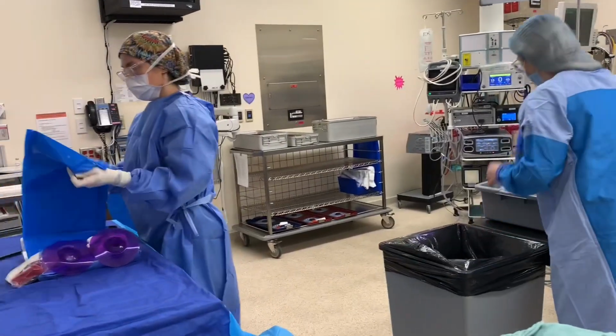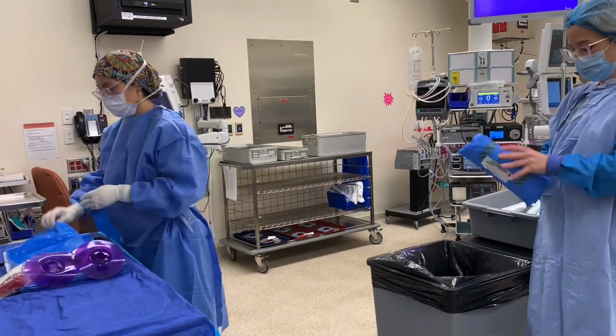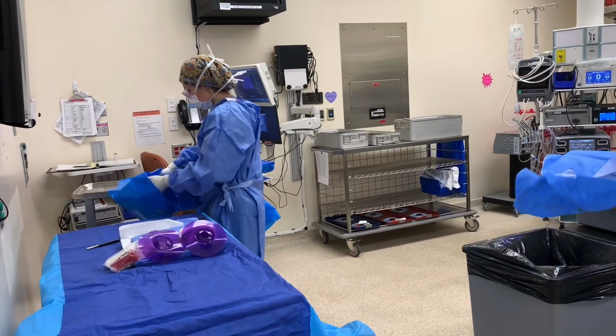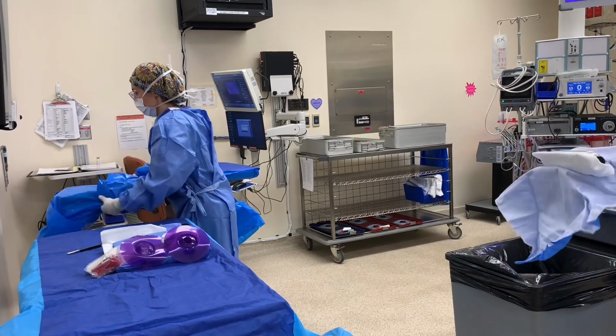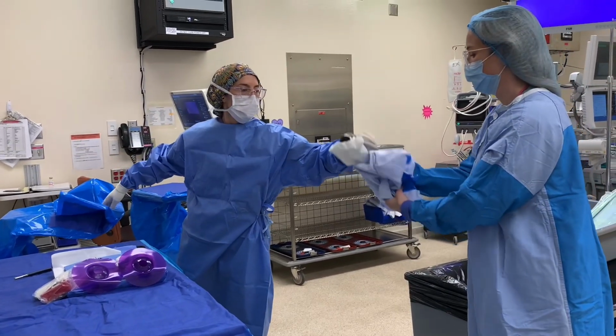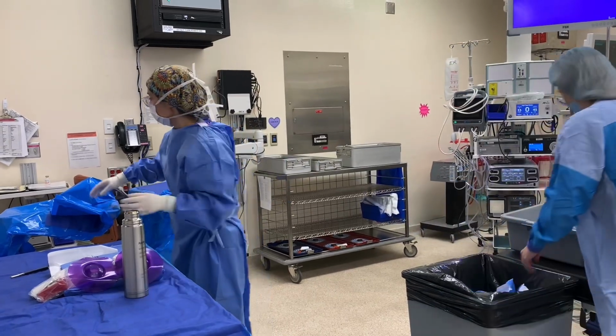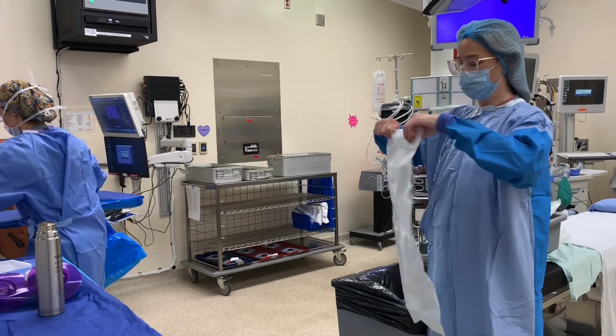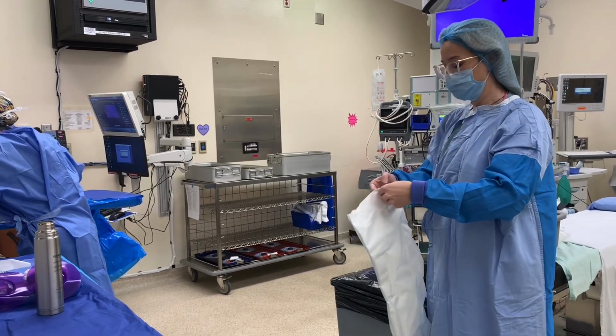To utilize the efficiency of this standard, scrub nurses should put all their items where they will go, not directly in the basin. The ORNAC Standard 2.17 states that sterile items shall be presented directly to the scrub nurse or placed securely on the edge of the sterile field. Items shall not be flipped. This is to improve patient safety by reducing our infection rate.